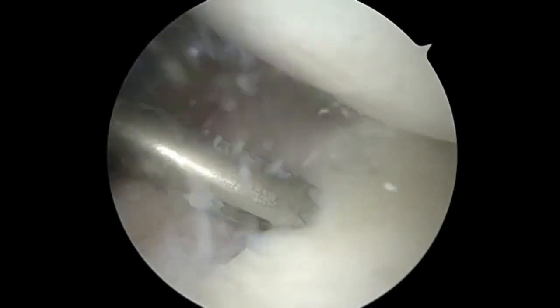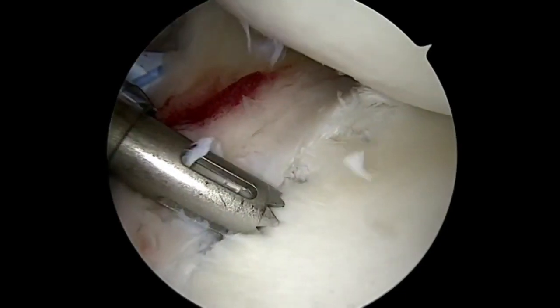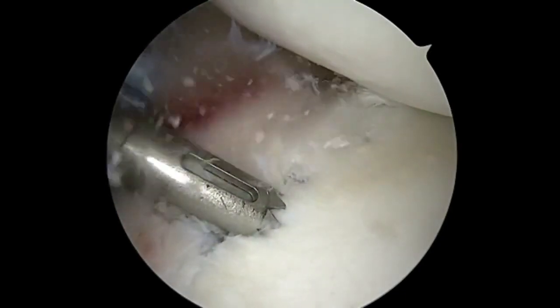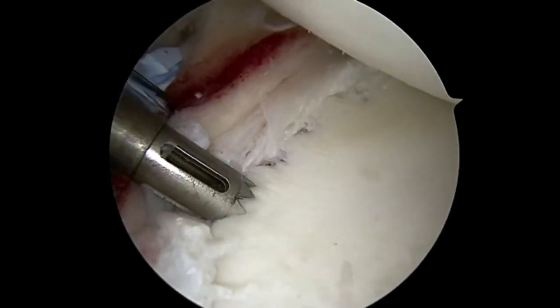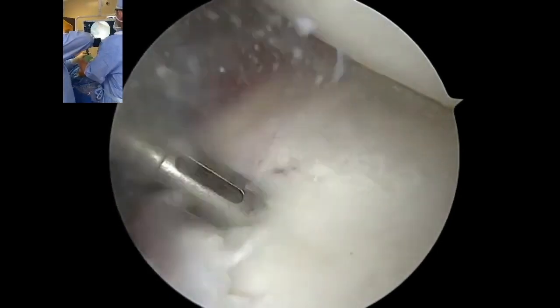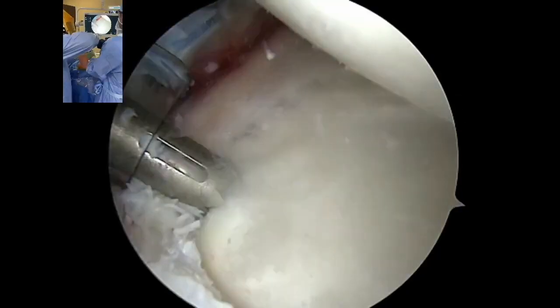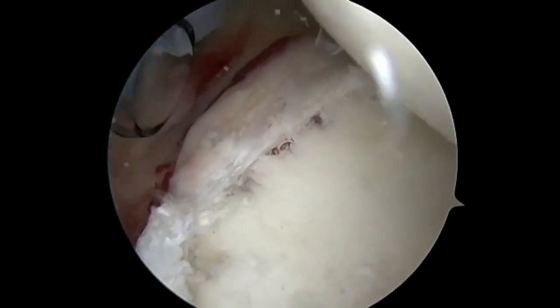We like to place as many anchors as possible. We feel that this ensures the success of the procedure as it does with anterior labral repairs. These holes are drilled as close as possible to each other without compromising the previous one. In this football player, we're going to place a total of 5 anchors posteriorly. Having your portal positioned correctly to get the correct trajectory is very important.